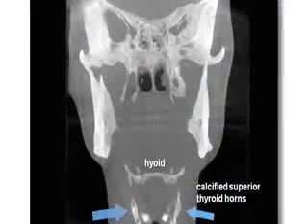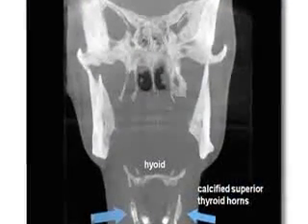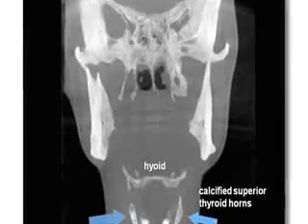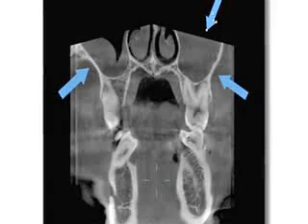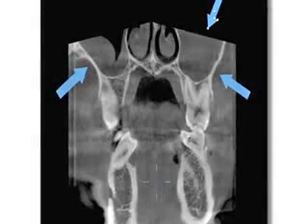And it's actually quite simple to do, because you can correlate those three planes of section when you find an anatomical structure, let's say the hyoid bone. You might see it in an axial plane of section first, and then it's quite simple to switch to another plane of section and confirm, one that they're more used to looking at, like the sagittal view, or the side view, if you will. So anatomy is important. They have to spend some time. They have to find the resources to do that.